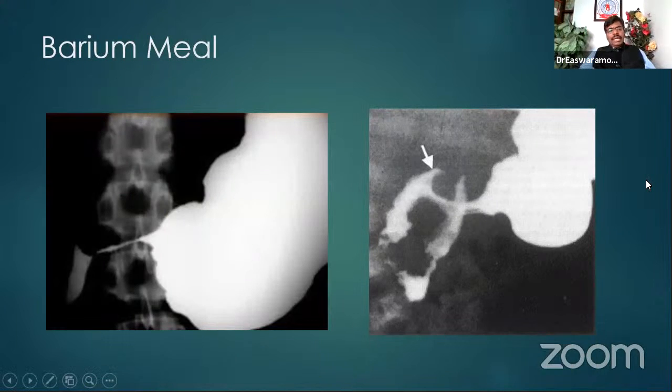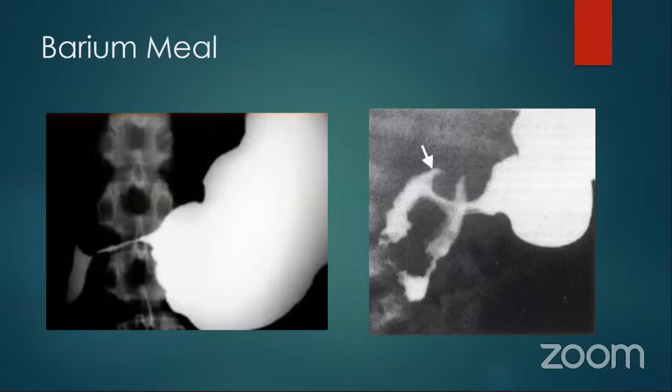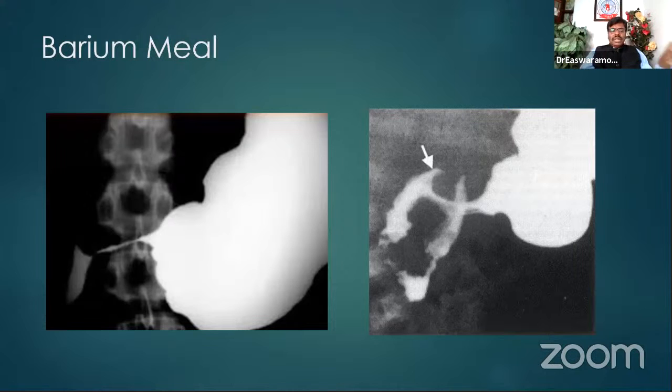Next, we'll go into the barium meal. One case they'll ask you how the barium swallow and barium meal are done. That is what we used to ask before. Nowadays, it is mainly a technician's job, but still, as a CRRI, what we expect is that you should have visited the radiology room at least once in your lifetime to see how they perform this investigation, how they do the imaging, the CT scan, the X-ray, some basic things, so that you can visualize. Then you can write half a paragraph on that, especially in theory.